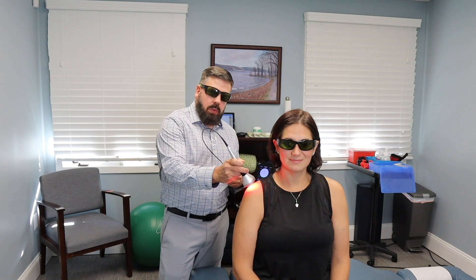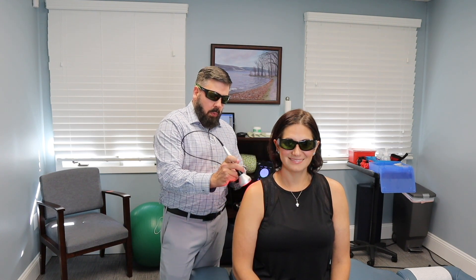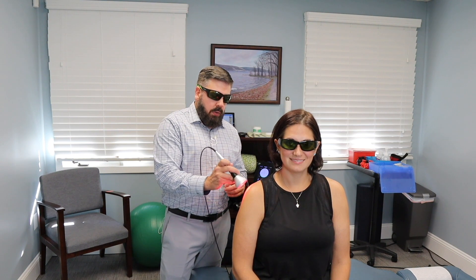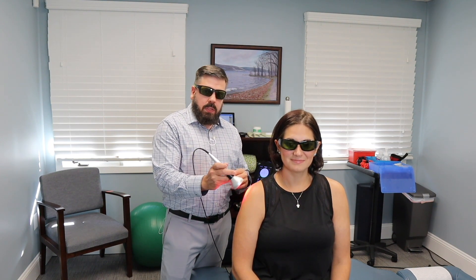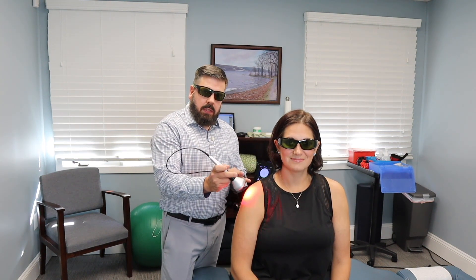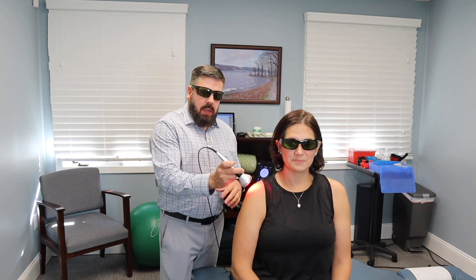We're going to apply the laser therapy right over the shoulder and work the whole joint — the backside, top side, and front side — to get deep into the capsule and remove any bursitis or inflammation. The patient feels a mild, deep warm sensation that is very soothing. The treatment typically takes about six or seven minutes. We do this first to relieve pain and inflammation before moving on to soft tissue treatment.